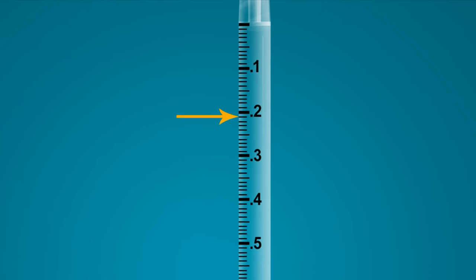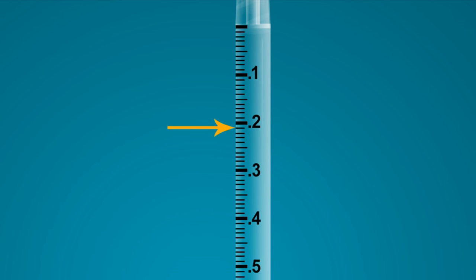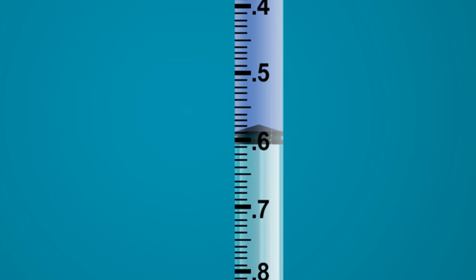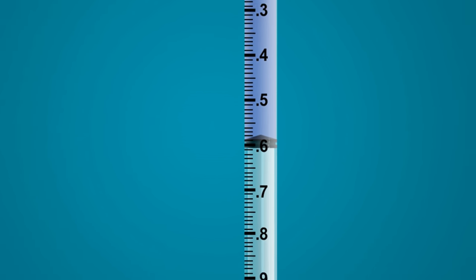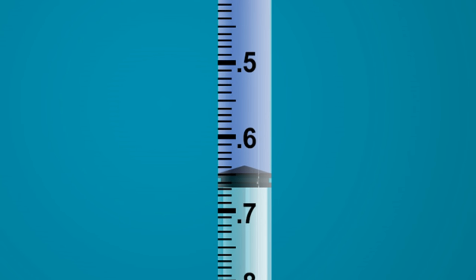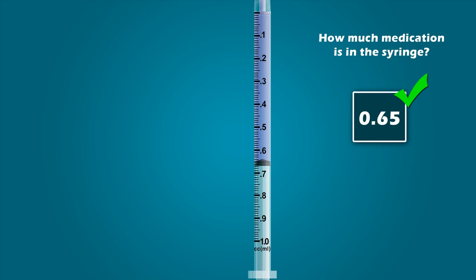So what is the value of this line? If you stated 0.21, you are correct. Now that you know the value of all the graduation marks, let's determine the amount of medication in the syringe. How much medication is in this syringe? If you stated 0.59 milliliters, you are correct. Try one more. How much medication is in this syringe? If you stated 0.65 milliliters, you are correct.